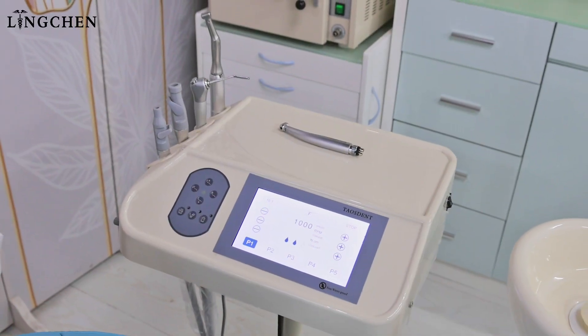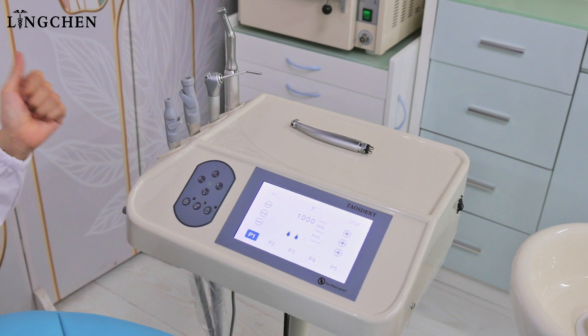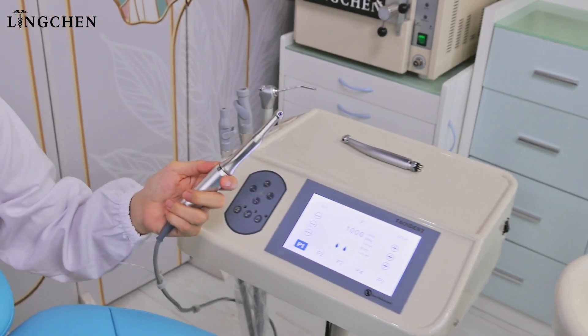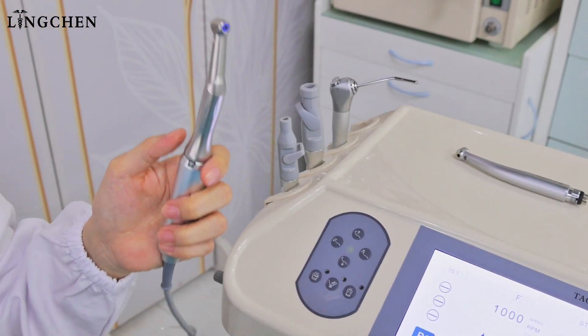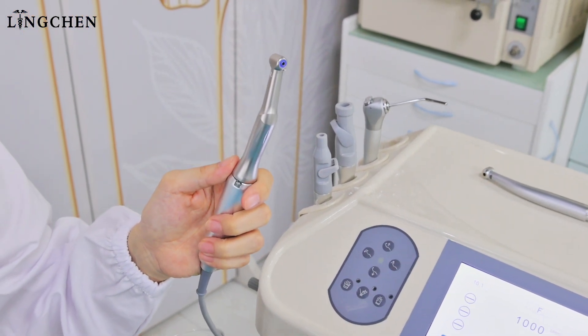Now we talk about the water on the implant motor. We made it a unique design. The implant motor — we can control the water amount and the water speed from the dental chair unit itself. So it is much easier for the dentist working.